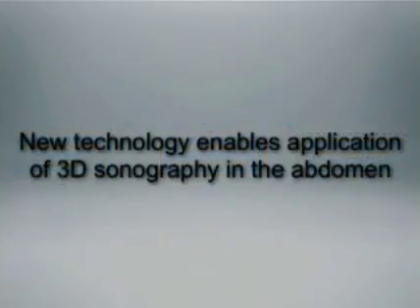Over time, however, the new technology that enables the further application of 3D in the abdomen, just as it did with color and as with endovaginal sonography in real time before, will become more available and eventually will be available on all or most machines in our lab and many other labs, and that will drive further applications of 3D sonography in the abdomen.